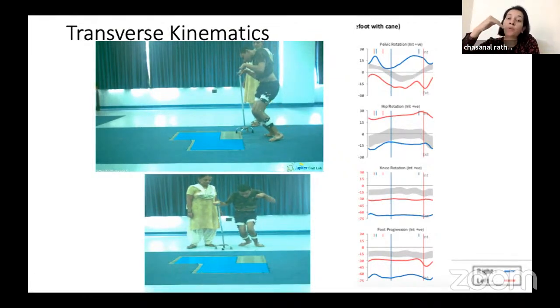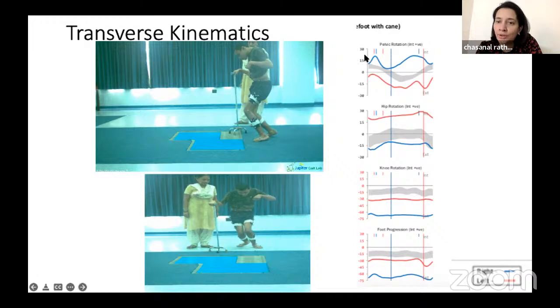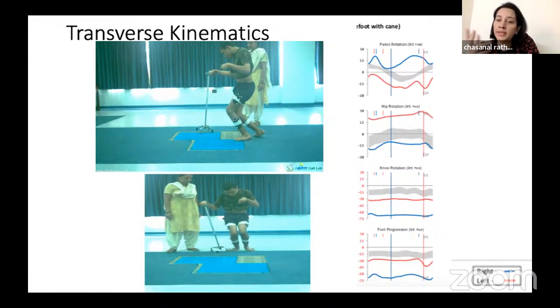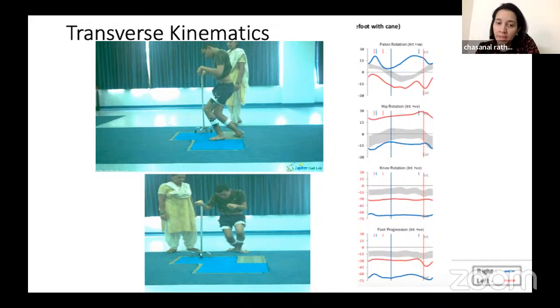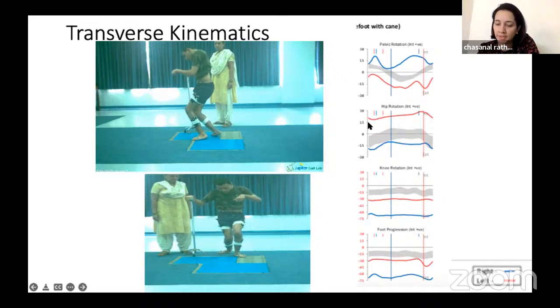you would be seeing, probably imagine seeing it from the patient on the top, whether the pelvis is being internally or externally rotated, is the hip internal or external. These are very difficult, plus difficult to correlate, and there is a lot of compensation happening here, you will see in this patient. And at such times, a rotational CT profile helps us much more to ascertain our findings on the gait here.